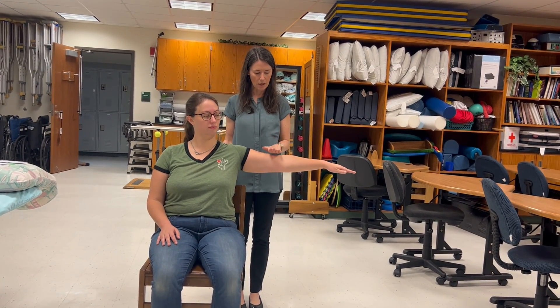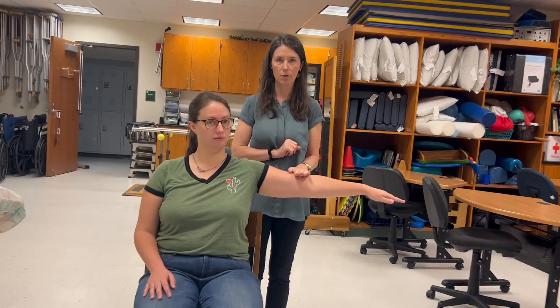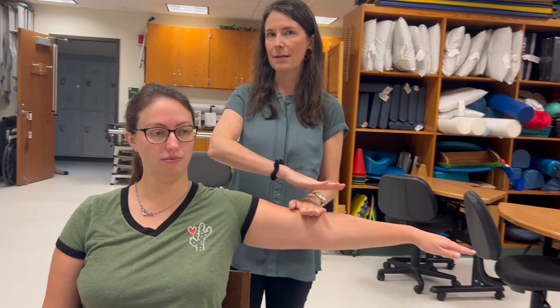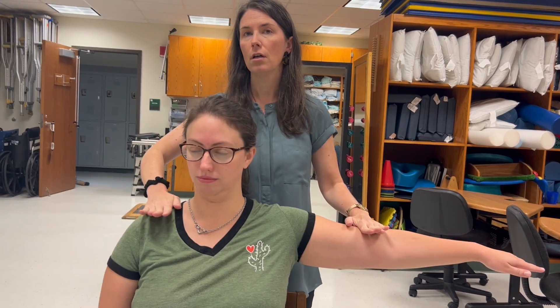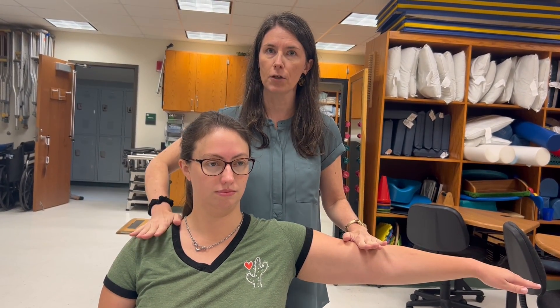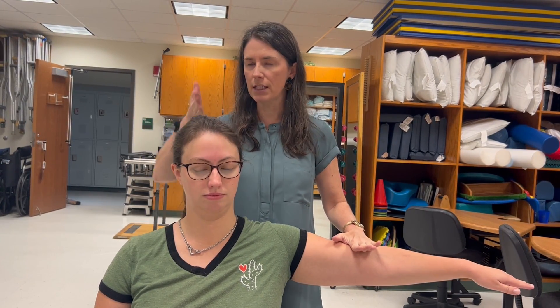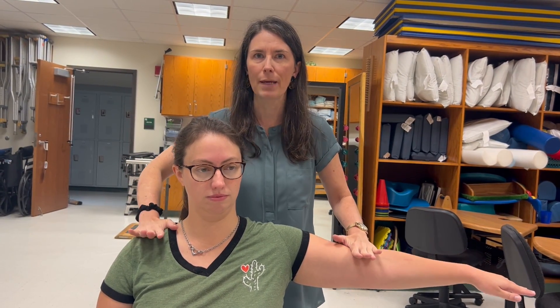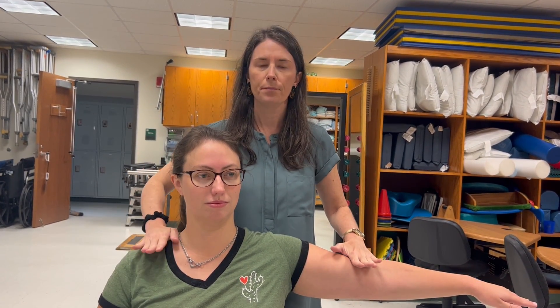My resistance is going to be at the distal humerus, just proximal to the elbow. My stabilization is on the contralateral shoulder on top — give good stabilization, it's not just there for show. The reason stabilization is on the other side of the spine is so that when I push down, there's an equal force on the opposite side.